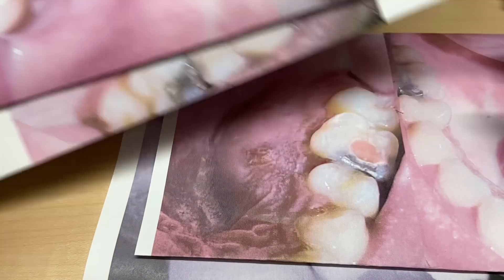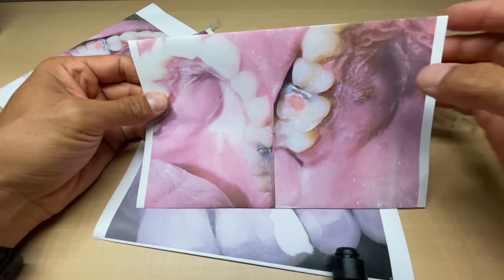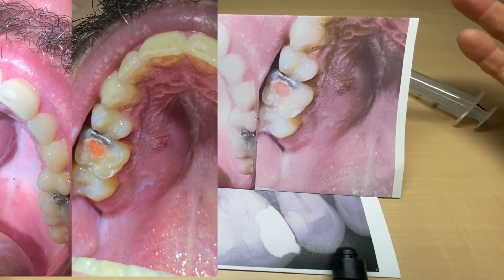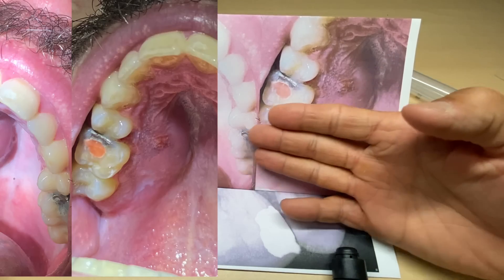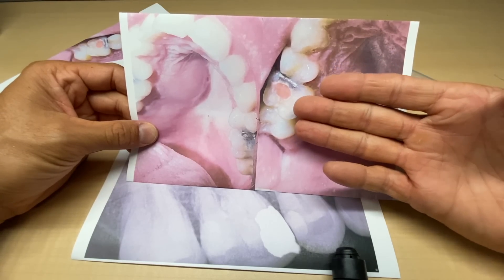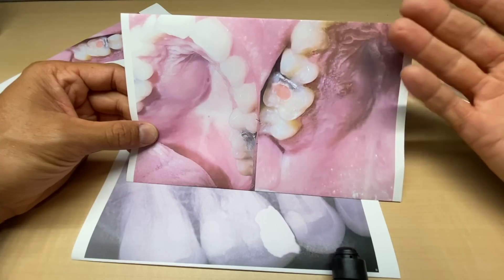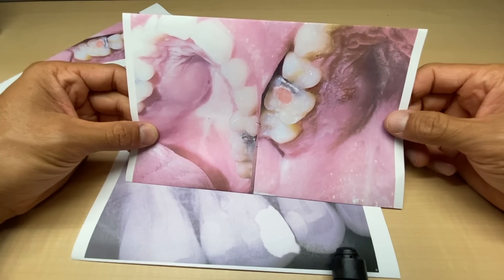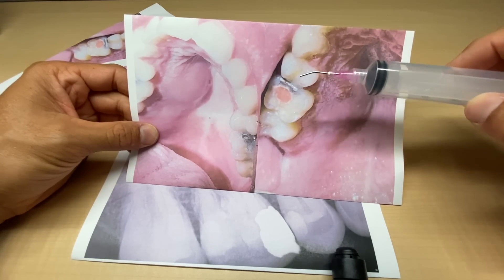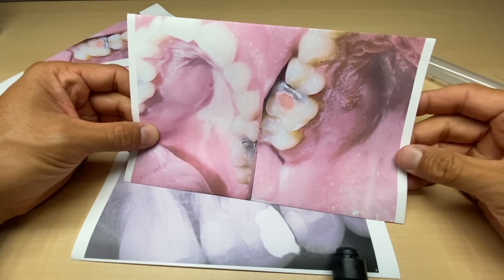We sealed the patient up. Upon the patient's return — reappointed 24 hours later — you can see definite healing starting. The patient's pain went from 10/10 down to 1/10, which we hoped for. Slowly we're going to get full resolution of this lesion. Aspiration is a really important step, especially with large lesions, just to make sure you don't get into a vascular lesion — that's the key point.